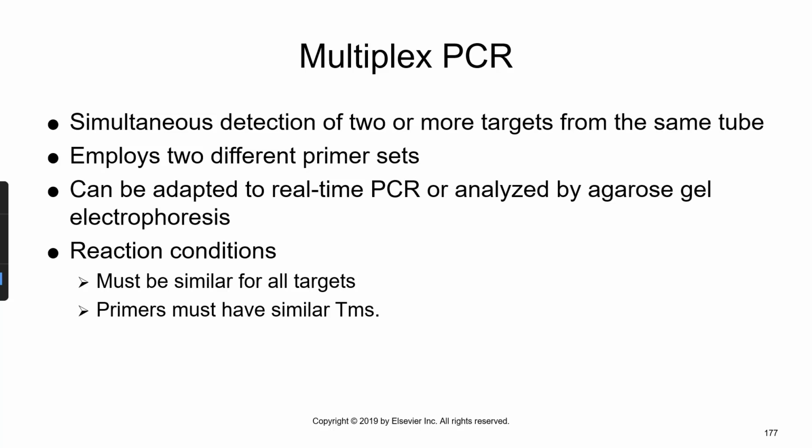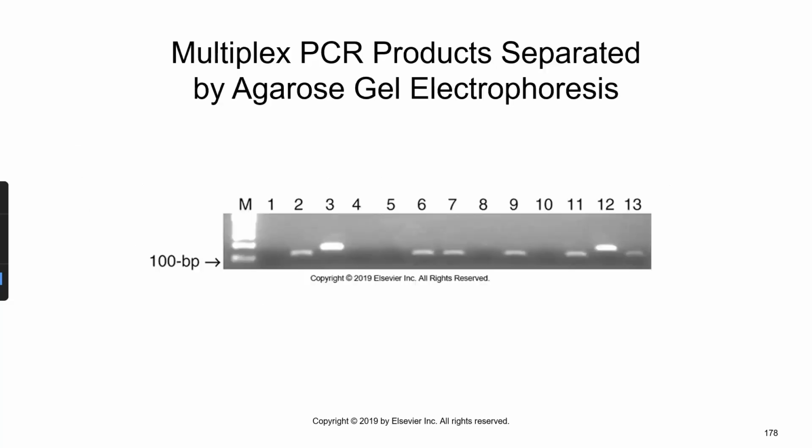But they have found a lot higher sensitivity and specificity using these multiplexed PCRs compared to standard culture methods. So instead of plating them on 50 different plates and spending the money on all that, you spend the money on the molecular diagnostics, and it has equal to or greater specificity and sensitivity than our traditional culture methods. So this is what a sample multiplex PCR would look like by gel electrophoresis.